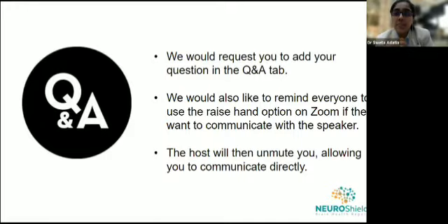These are the times when I personally prefer to do an MRI and look into the diffusion and FLAIR mismatch. Or if I have a perfusion scan or software like RAPID, that gives me a very confident understanding of how much is the infarct, how much is the core, and whether this is the time to thrombolyze or not. This is exactly the tissue method that we're talking about. However, if the patient's last seen normal is also not known, it is always wiser to follow through with a CT angio as well as an MRI when the time is not clear. When the time is clear, absolutely 4.5 hours. If there is no contraindication, go and thrombolyze.